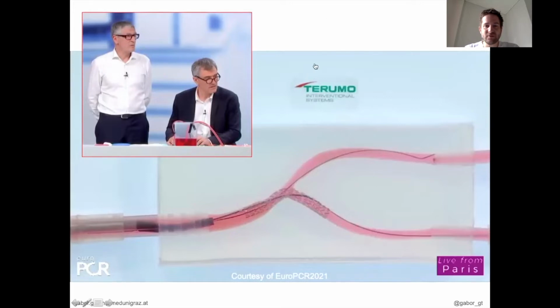I would like to invite you to follow this little clip where yellow line shows the proximal stent edge at the beginning, while red line shows the distal stent edge at the beginning, and operators performed here really a perfect potting, large enough to achieve proper apposition, positioning the balloon nicely to the carina as suggested by the panel, as suggested by the commenters, and by this perfect POT, multiple POTs, at the end the case ends with a significant elongation, proximally elongation of a couple of millimeters.